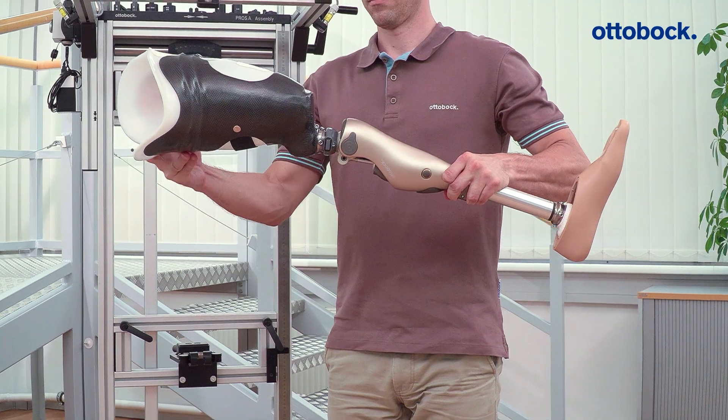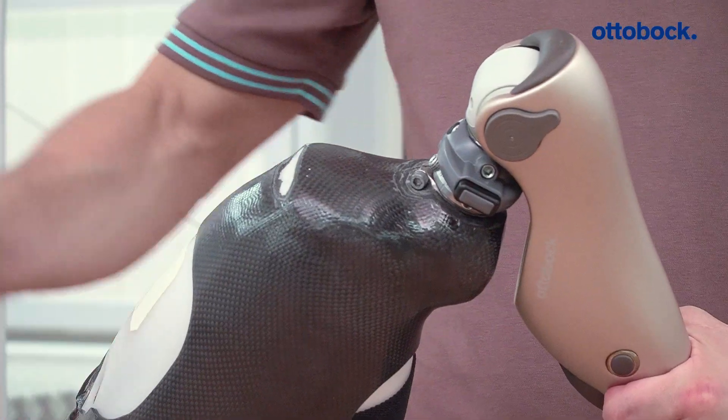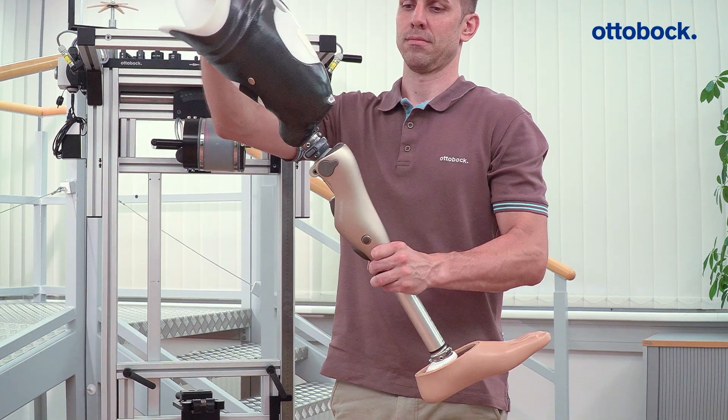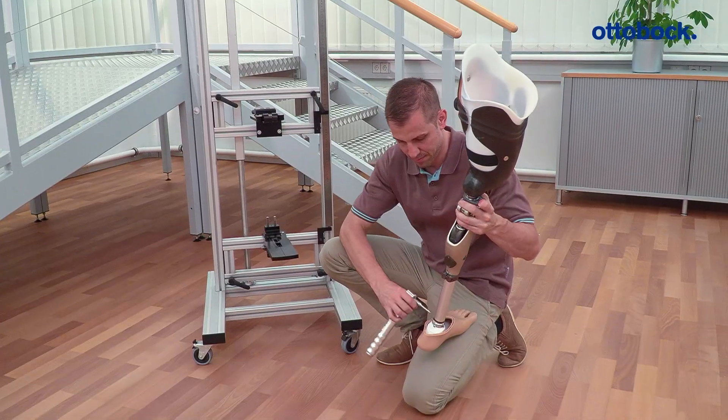Check the distance between the socket and the hydraulics with the knee joint in maximum flexion. Also make sure there is space between the socket and the top of the knee when the knee joint is in full extension. Tighten all screws to the specified torque.